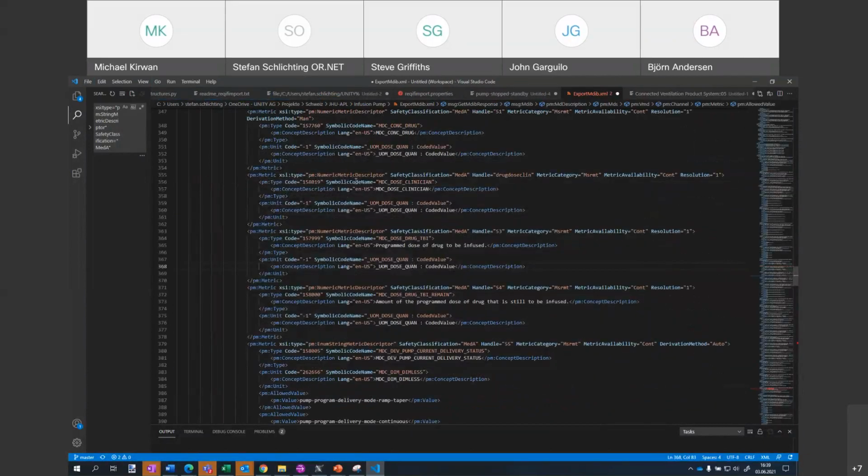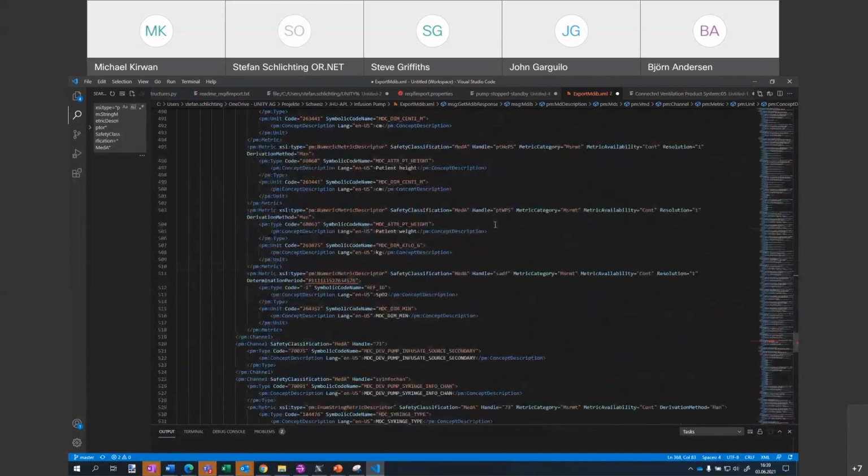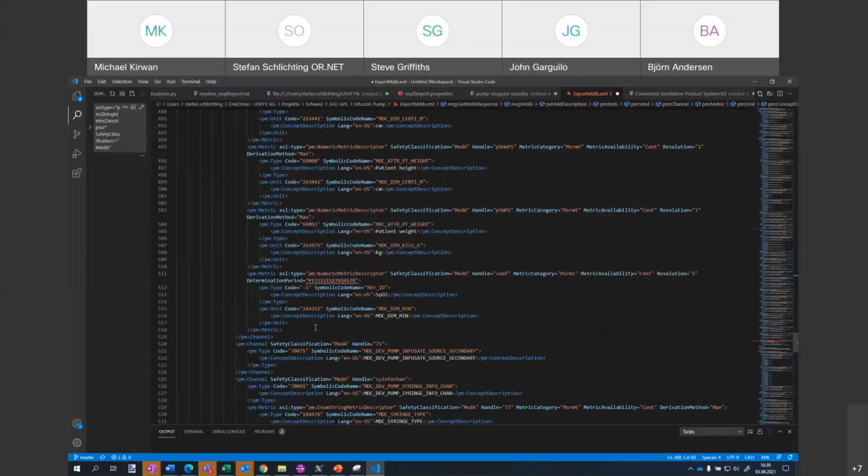Now actually the pretty printer works again, which is funny. And you see here, he said, well, this is not, of course, a duration, because now it does the XML schema validation. And by the way, here's our metric.